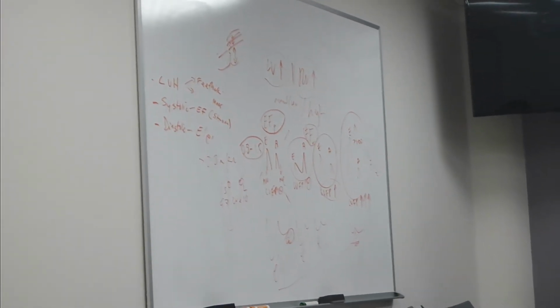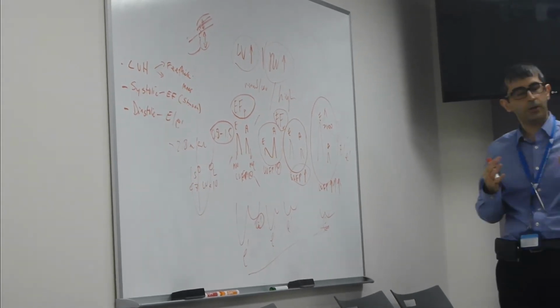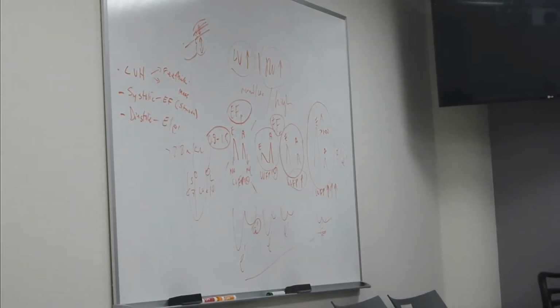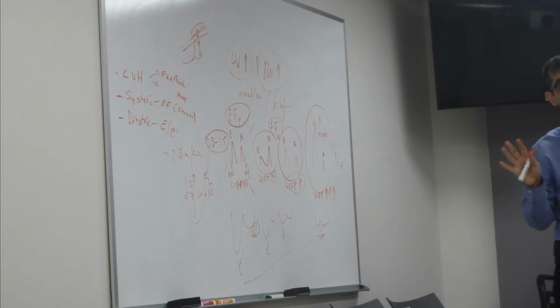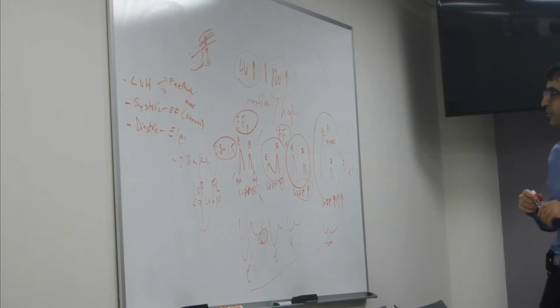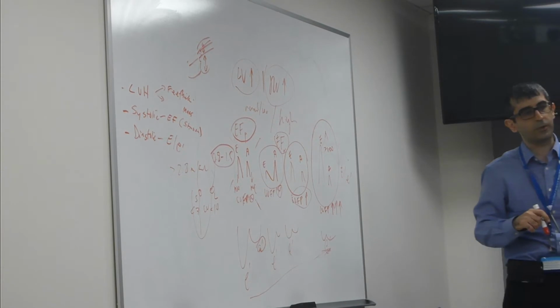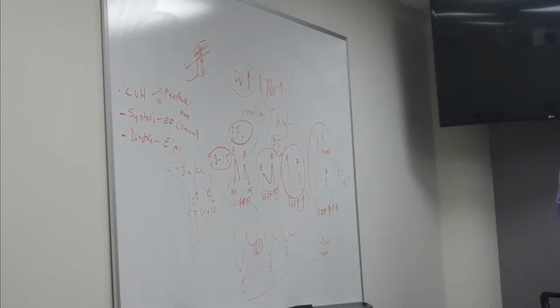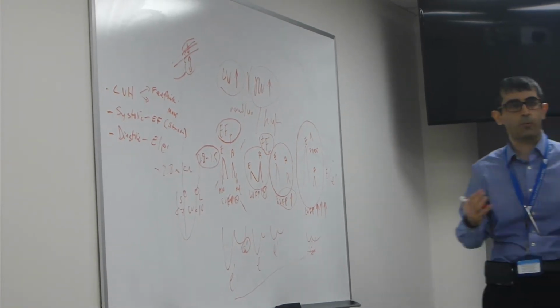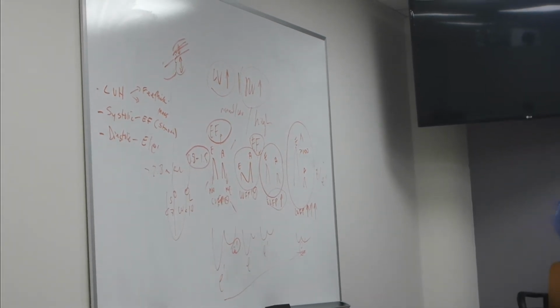So in our practice, in the lab, the way I usually report this with preserved EF or not, there are situations where you can't, then you don't comment on it, you don't say anything. It's better not to mislead people, right? But in general, I would say abnormal filling pattern is suggestive of elevated filling pressures. If I'm confident the filling pressures are high, I say so, or I would say resting LV filling pressures are probably normal. That means I'm confident that the LV filling pressures at this stage are normal.